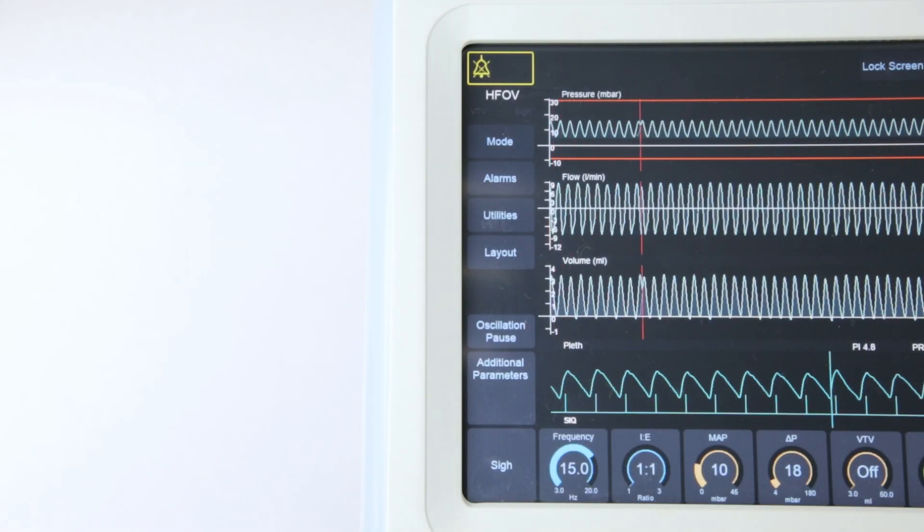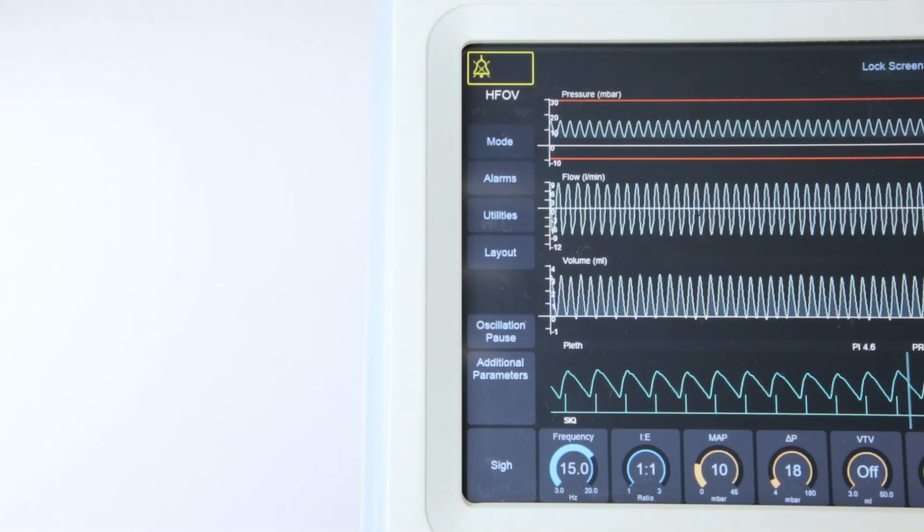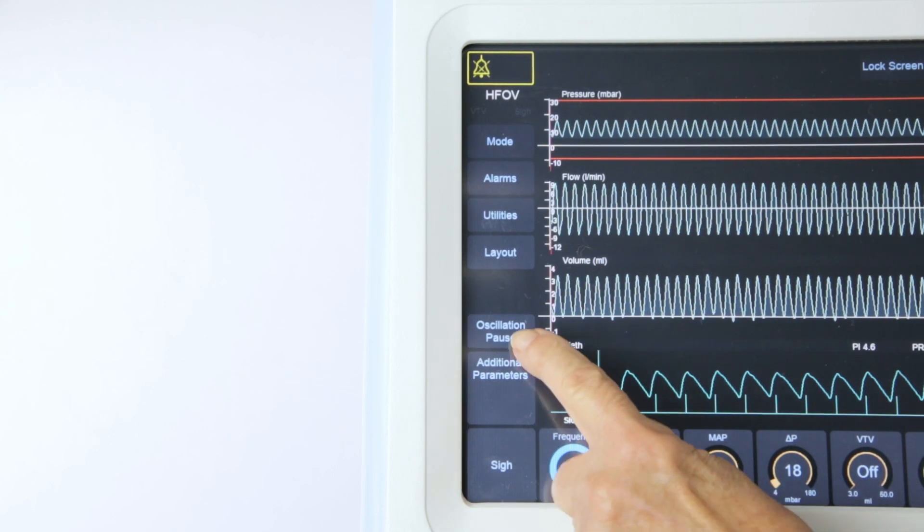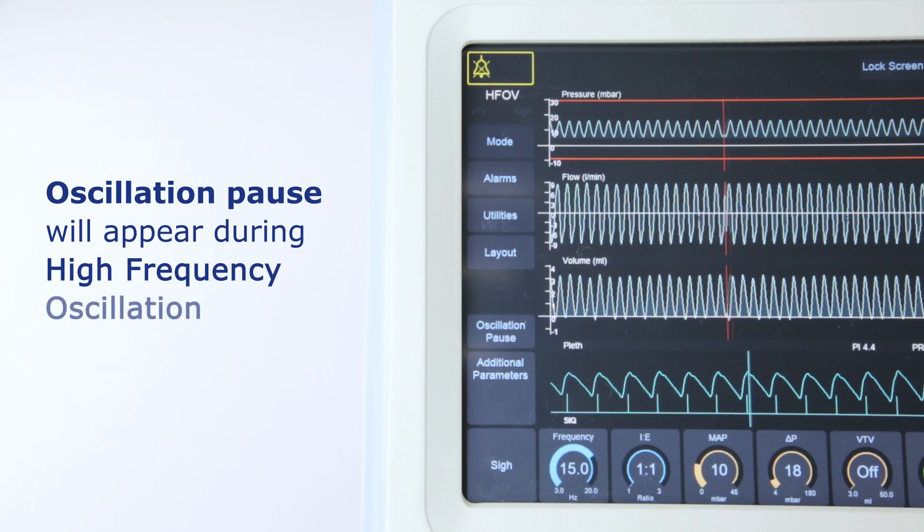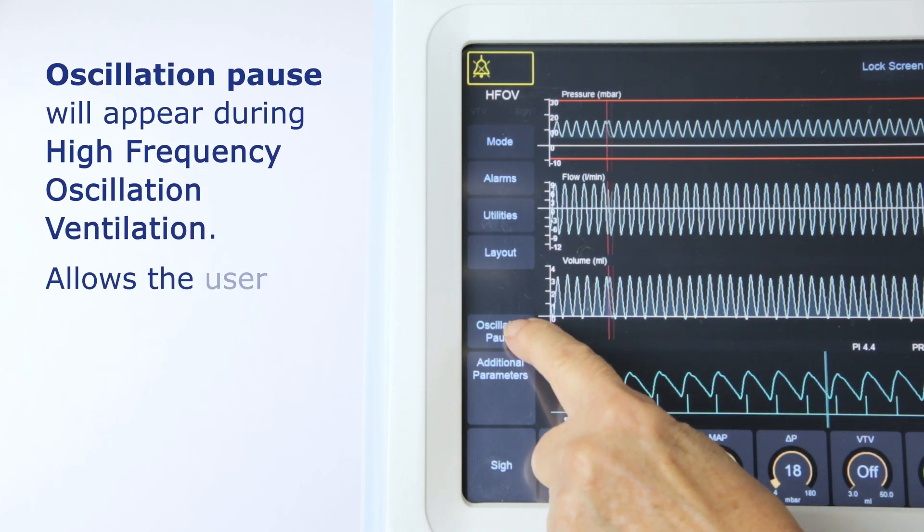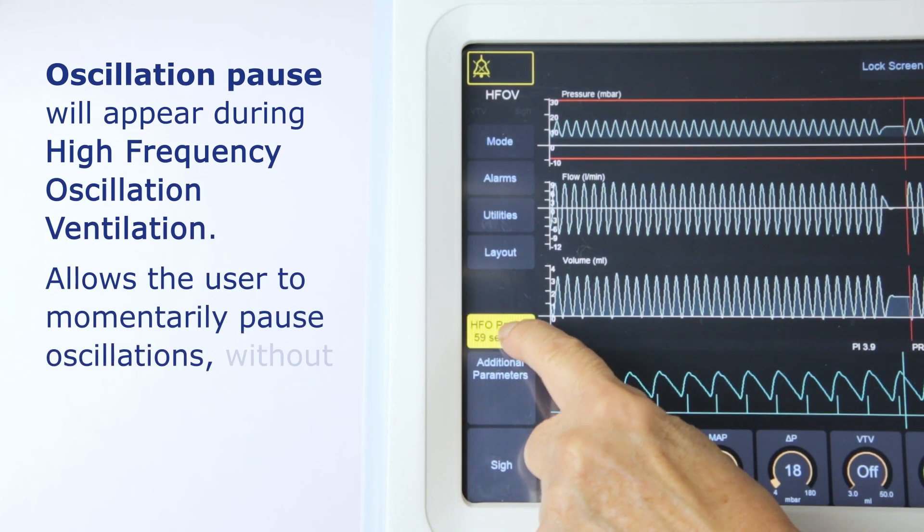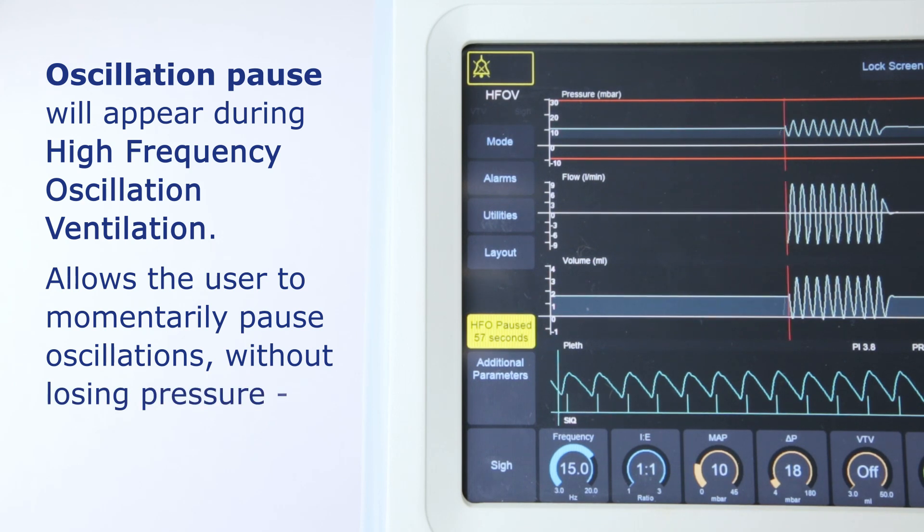Moving back to the left-hand side, beneath the Layout button is space for messages and other buttons. For example, Oscillation Pause will appear during High Frequency Oscillation Ventilation, and allows the user to momentarily pause oscillations without losing pressure, for X-rays, etc.